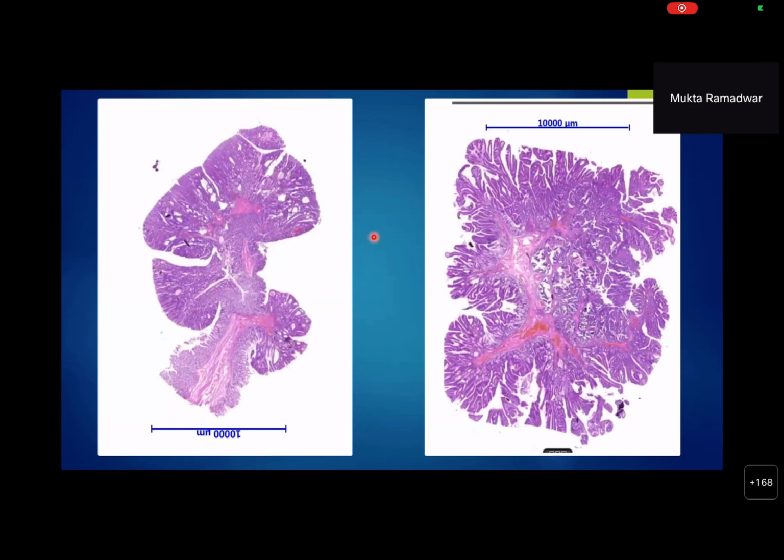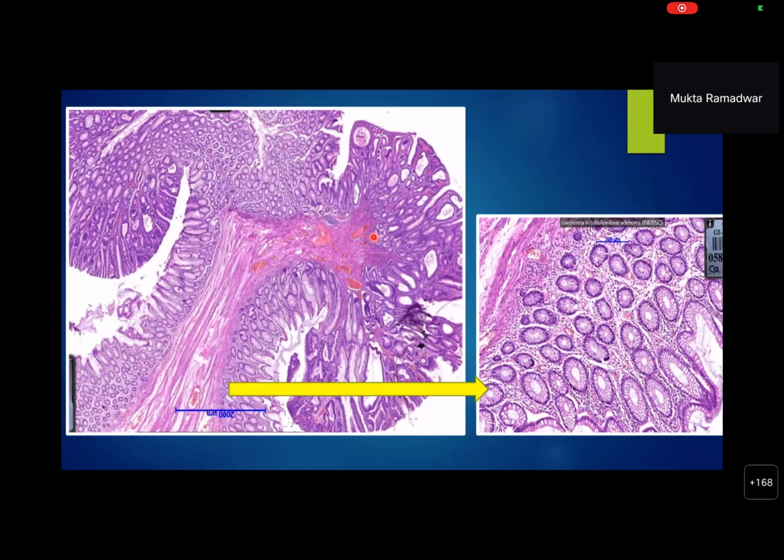So now we will move ahead. What I have pointed out is the stalk or the peduncle, that Shreyans correctly said makes it a pedunculated polyp. So let us see what the peduncle looks like on higher magnification. Shreyans, what can you see at the peduncle? Ma'am, on the left side, it is showing a stalk with polyp arrangement, and the polyp is having an increased amount of glands. I am not telling you to go higher up on the actual polyp. We are still at the stalk here. Yes. And I have magnified the epithelium that is lining this stalk. What can you see here?